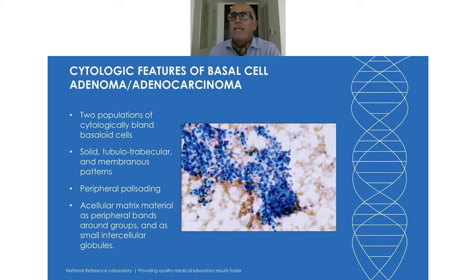These are the categories from the Milan classification, of course. You might not be particularly used to it, but more or less they represent the main categories which we've been using in the past. So please feel free to go through.